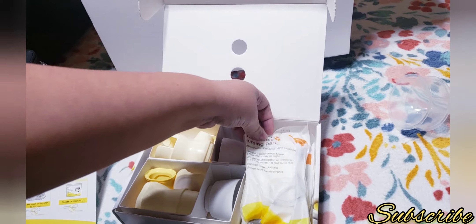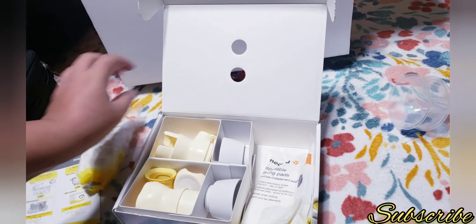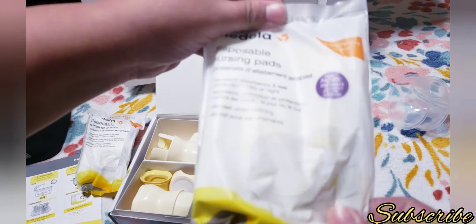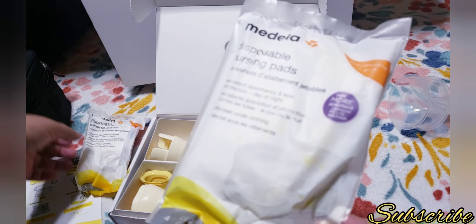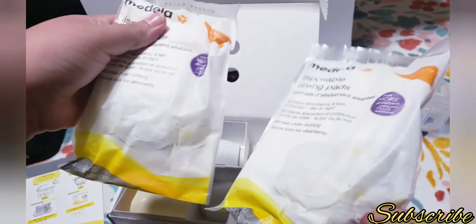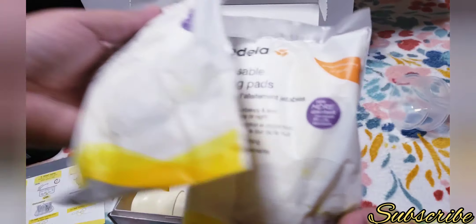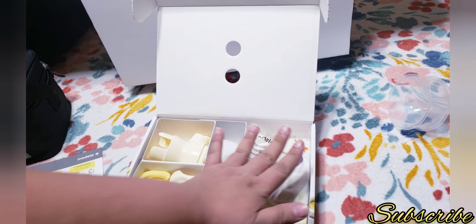It also comes with some disposable nursing pads from the Medela brand. It comes with two packs, four pads each, so you have eight Medela disposable nursing pads total. That's a nice detail that they included.